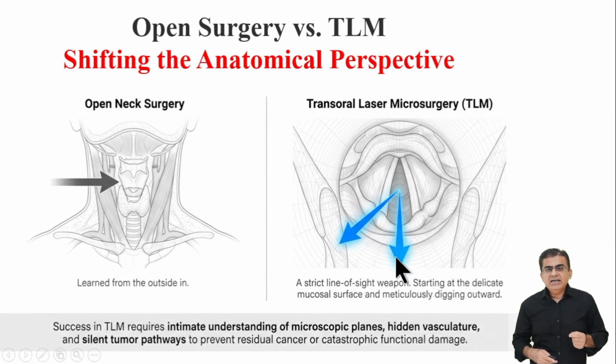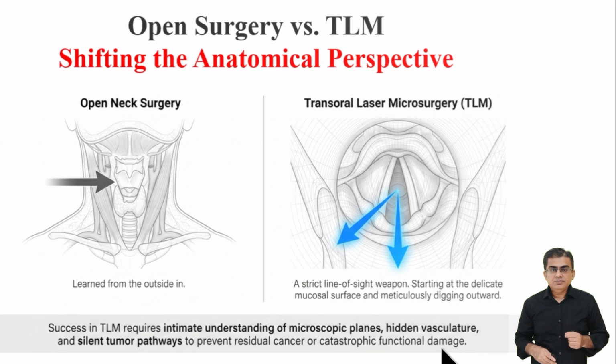If you do not completely understand these microscopic tissue planes, you will fail. You will either leave residual cancer behind in the deep spaces or you will cause catastrophic, irreversible damage to the patient's voice. This is why your spatial awareness is your most important surgical tool.